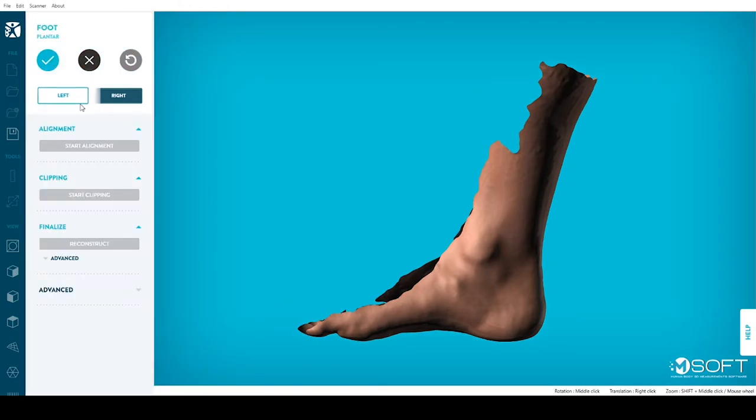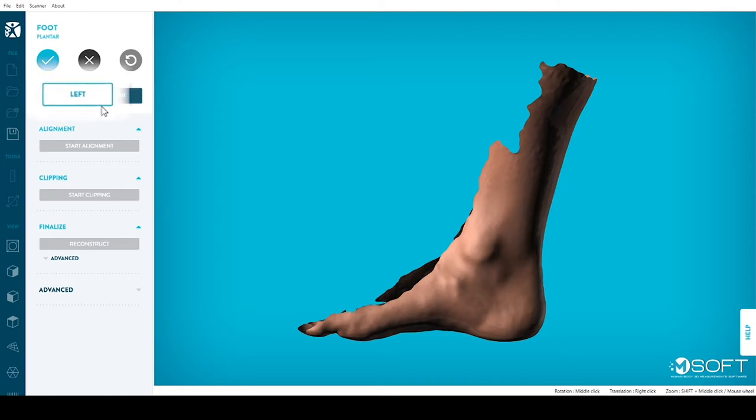Second, repeat this process for the other foot, if applicable. Always make sure you selected the right foot in the menu on your left.